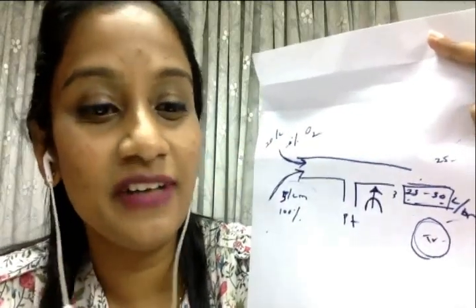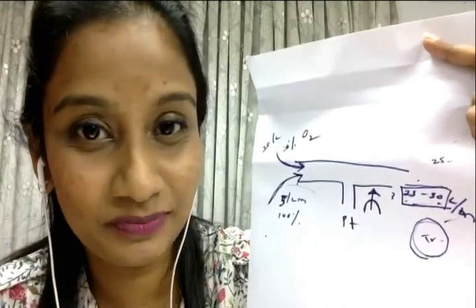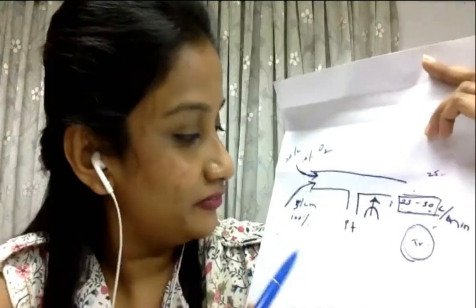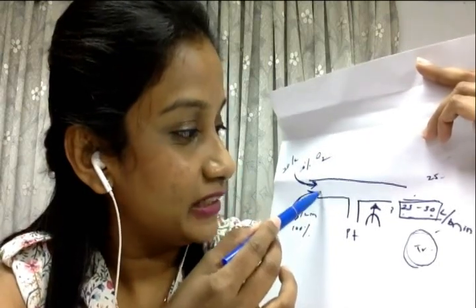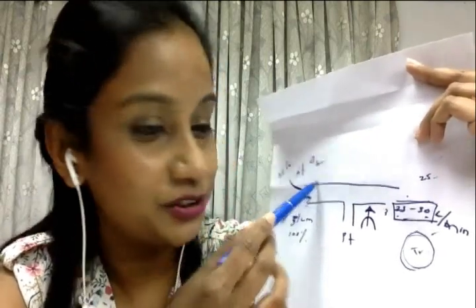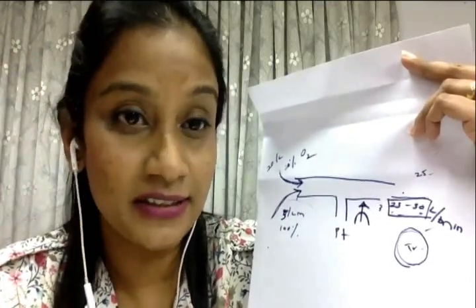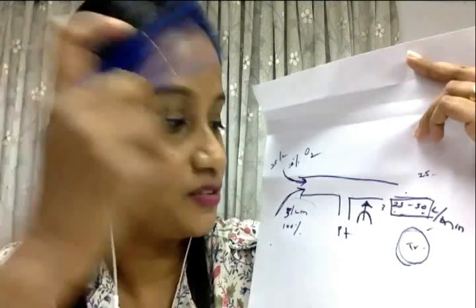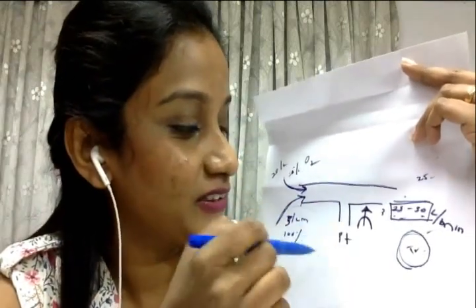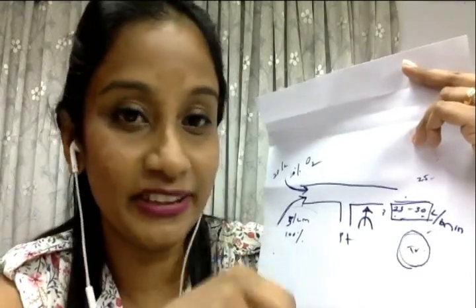That is why those devices are called variable performance devices, in contrast to fixed performance devices. Whereas in fixed performance devices, this ratio of entrainment is actually designed by the manufacturer, and it is a fixed proportion. So the fraction of oxygen that goes to the patient is going to be somewhat fixed.